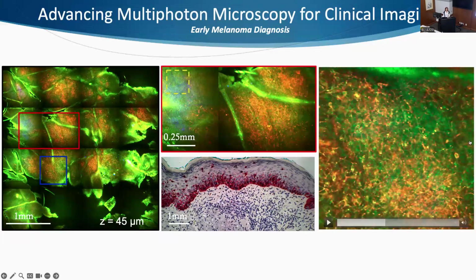How do I know they are melanocytes? Because the cells have these dendrites attached. Remember when I told you we care about maintaining the submicron resolution? That's because we need to image these types of fine structures. We need to be able to identify the melanocytes, and the spatial resolution helps us do it.